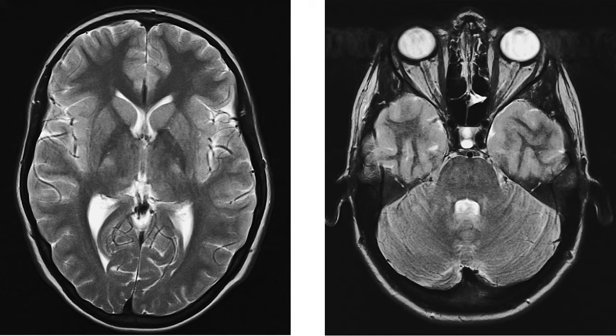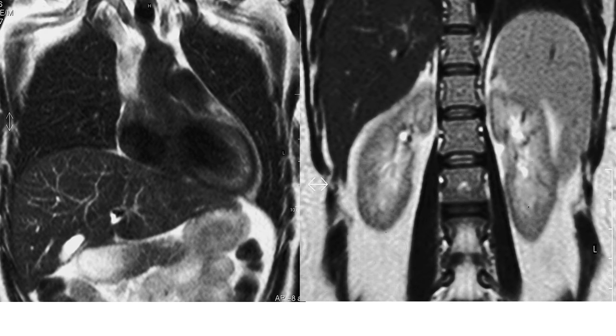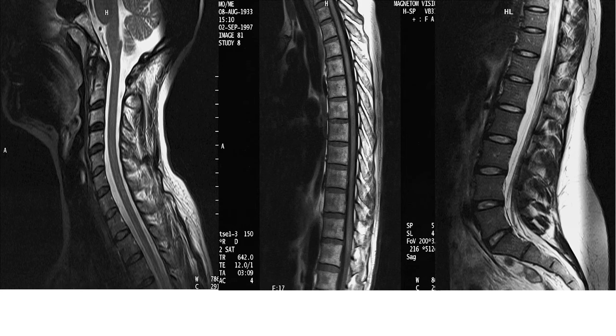So you can see another sample of the MRI. In this case, the mediastinum, the liver, the heart. You have the abdomen with the kidney, the liver, the spleen. This is the spine, the cervical, thoracic and lumbar spine. The MRI is also very good for the spine. We will talk more in the future about that.